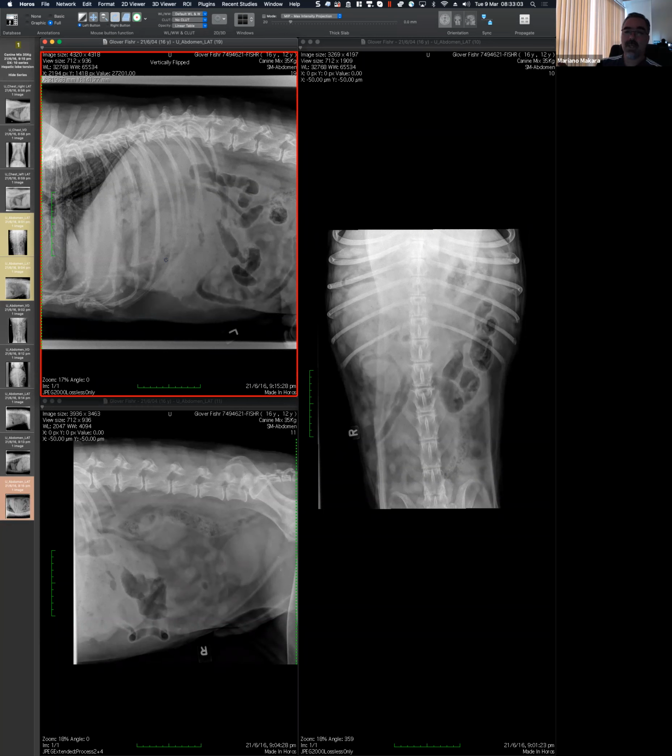In equine medicine, basically now the plates, or I remember the one that we bought at the uni last days, was even wireless. So that was still DR, makes sense? This is the plate, the detector, but there wasn't any wire attached to that plate. You could actually move it around and go anywhere and then take a radiograph, and then it will show up immediately on your computer.